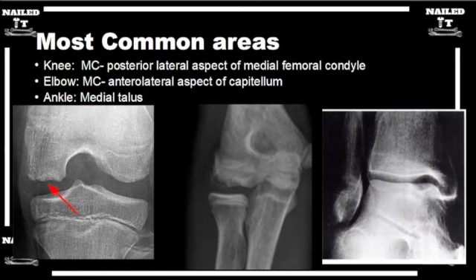And the patient that you gave as the case example at the beginning, an 18-year-old male football player, highly likely that his growth plates, his physes, are going to be closed. And he's had 4 months of pain and swelling. So if it's an OCD, which is what we're talking about, and you see that on x-ray, it's a high likelihood you're going to then go to an MRI in that patient, because his physes are closed.